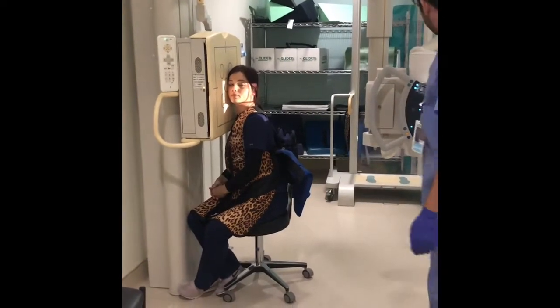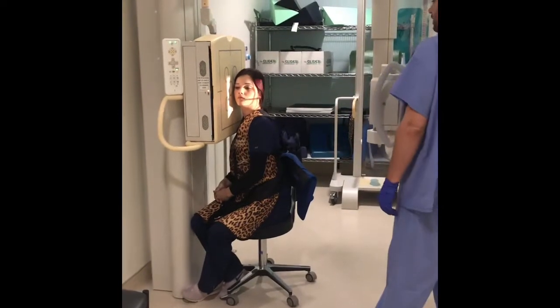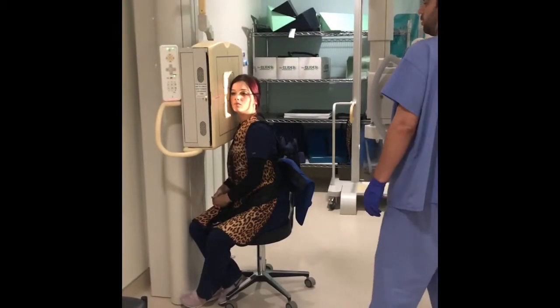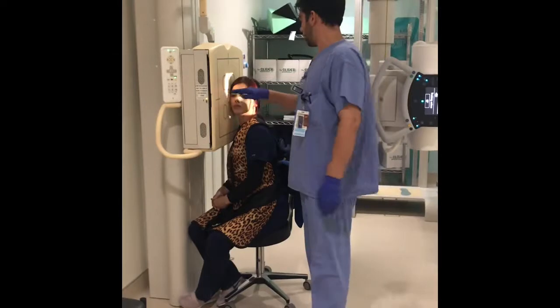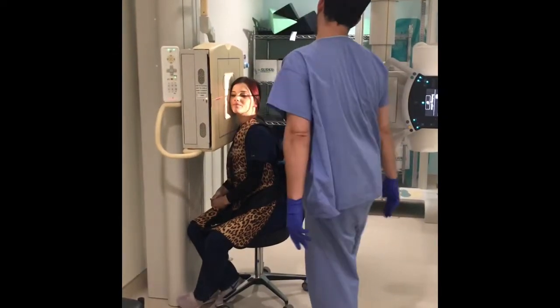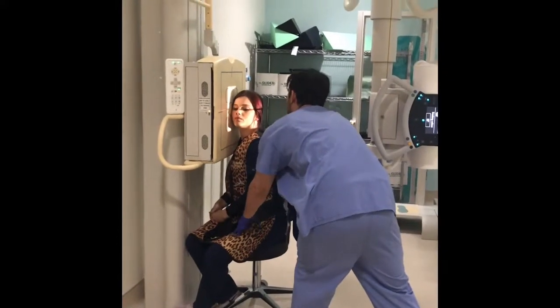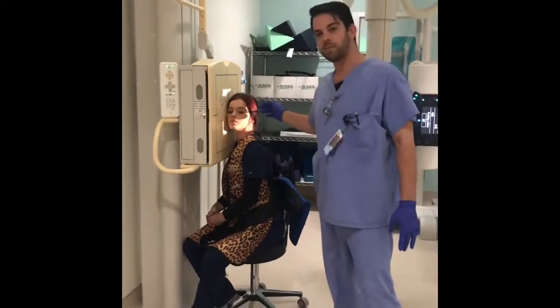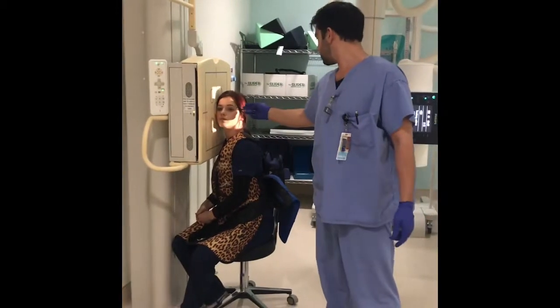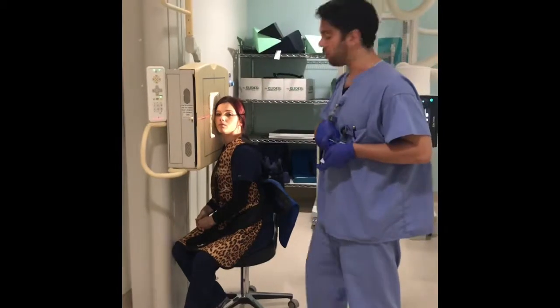So, the great thing about these new DR systems is they've got this laser right here that makes it quite easy to guide right across the line. So I'll just raise her orbital meatal line slightly there, and then bring her slightly forward. And now it looks like I'm centered pretty much a ½ inch to about a full inch posterior to the outer canthus. So this is a right lateral.